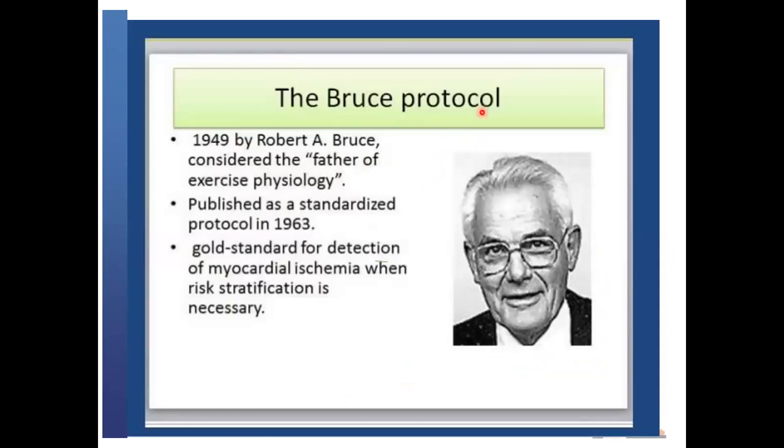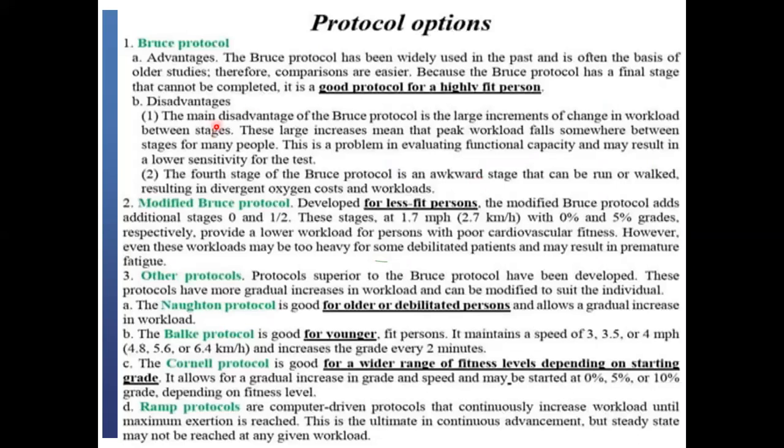So the Bruce protocol was first invented by this man called Robert A. Bruce, in the year 1949. He's considered the father of exercise physiology. He published a standardized protocol in 1963, and this has been regarded as the gold standard for detection of myocardial ischemia when risk stratification is necessary. So this is just a rundown of other protocols that we have. The most common, like I've mentioned, and the most standardized is the Bruce protocol.